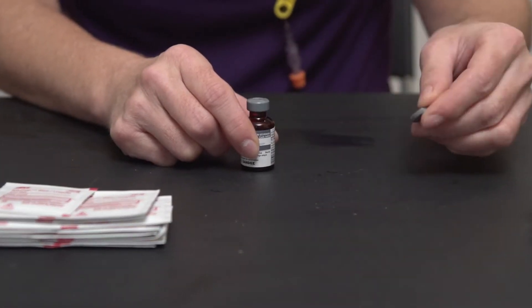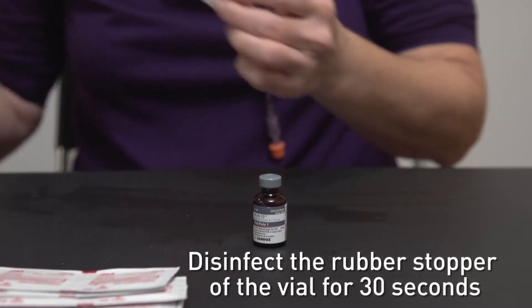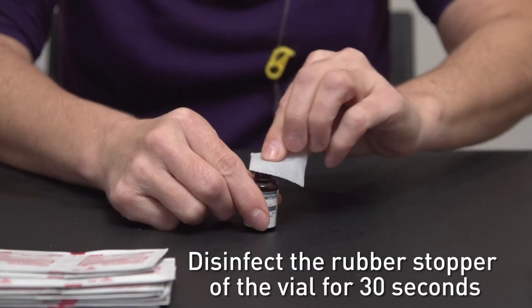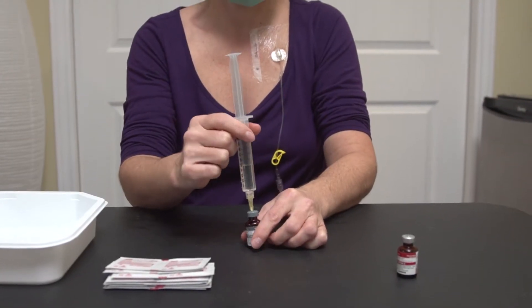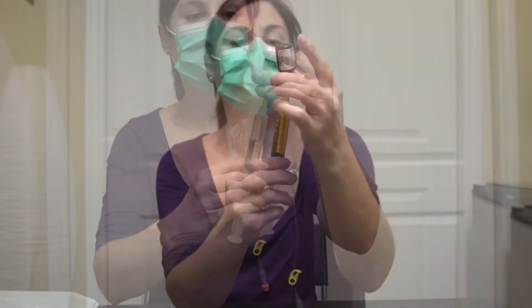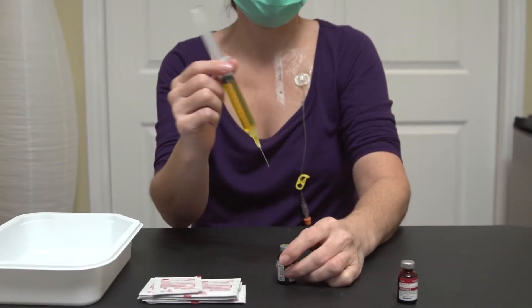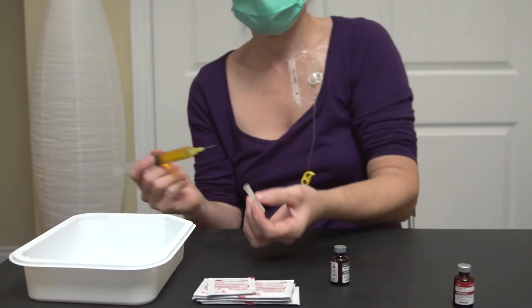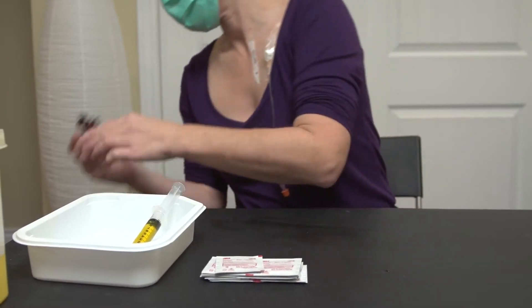Repeat these steps for the second multivitamin vial using the same syringe but a new alcohol wipe. When you are finished, put the syringe in the tray and discard the two multivitamin vials in the waste basket.